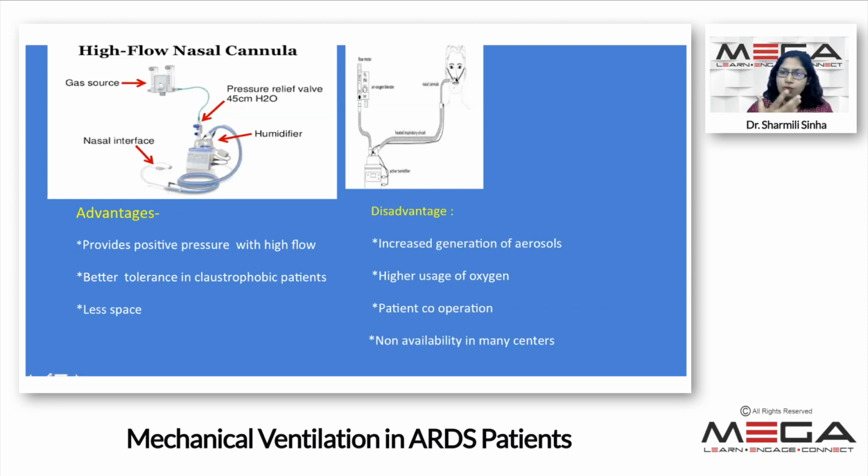So a lot of flow is generated, and it provides positive pressure with high flow, better tolerance in claustrophobic patients. Because remember, in NIV, when a mask is applied to the face, many patients feel claustrophobic and thereby they're uncooperative. But this is usually better tolerated by these patients.